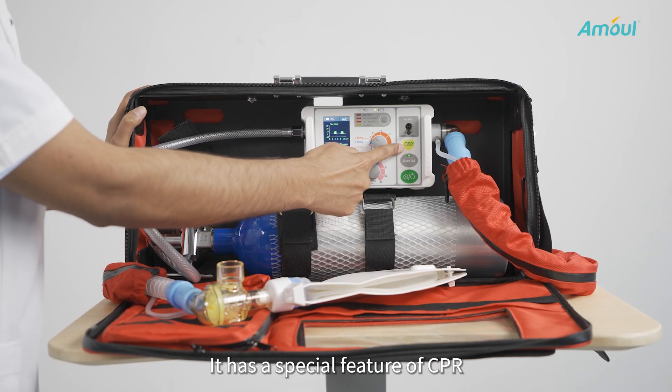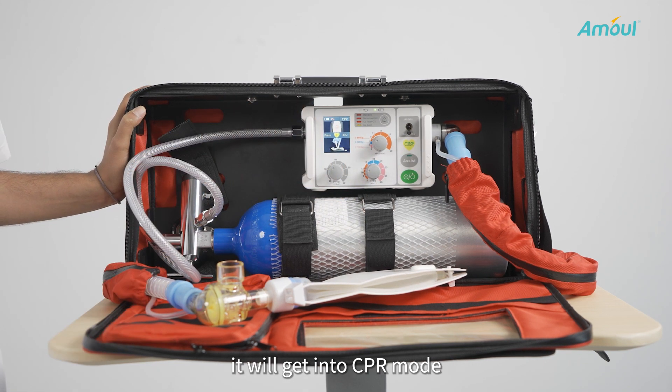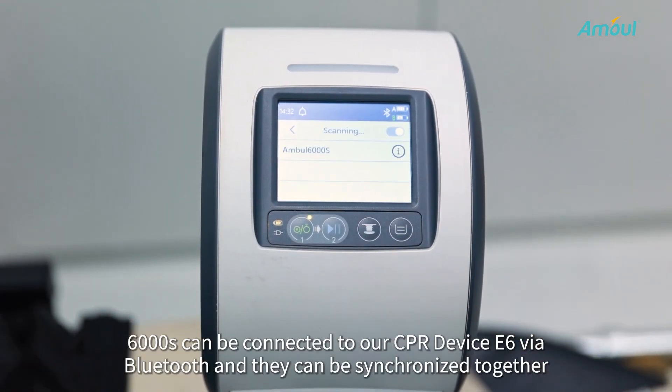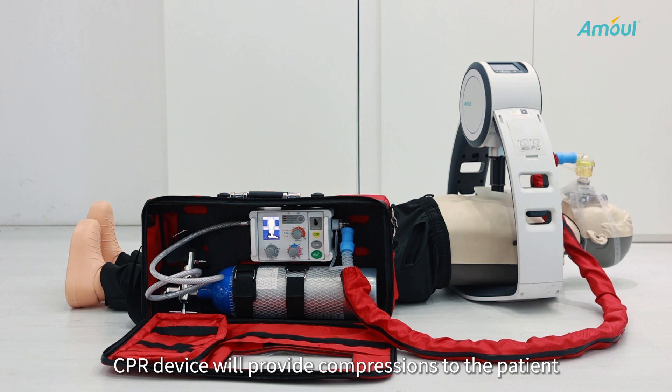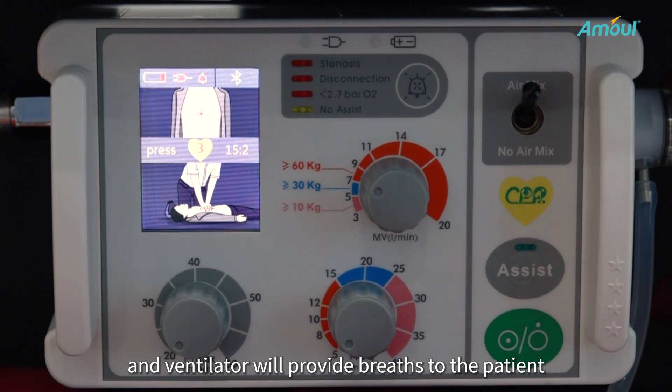It has a special CPR feature. By pressing the CPR button, it will enter CPR mode. The 6000S can be connected to the CPR device E6 via Bluetooth and synchronized together, so the CPR device provides compressions to the patient while the ventilator provides breaths to the patient.